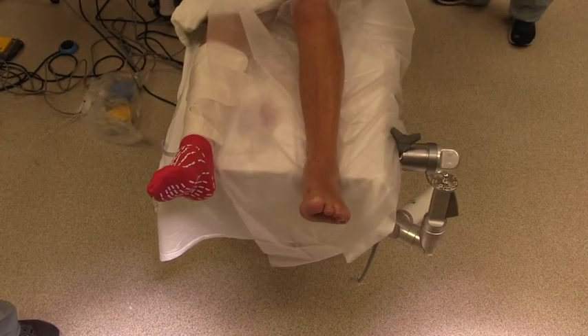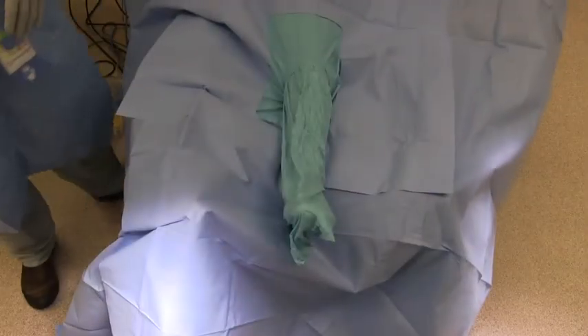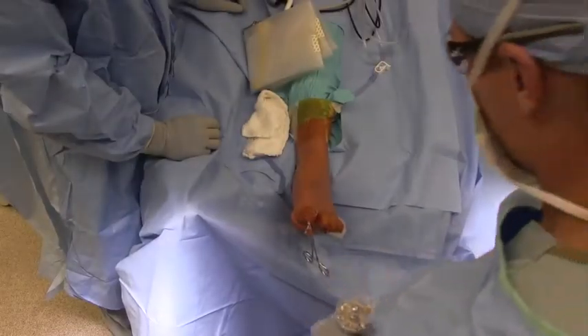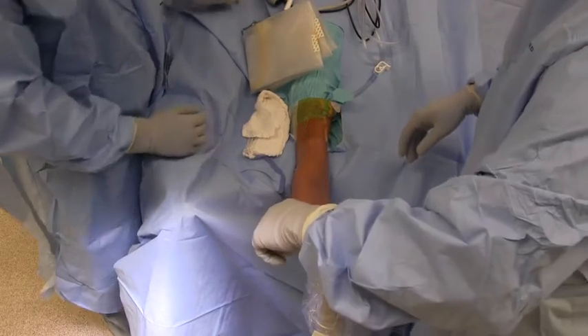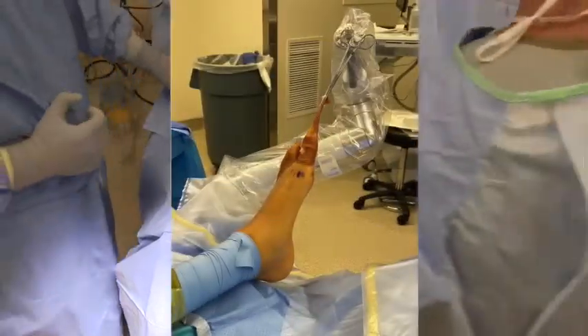Patient is placed supine on an operative table with the ipsilateral hip bump. Patient is then prepped and draped in typical sterile fashion. An external positioning arm is placed on the distal aspect of the bed to allow for joint distraction, thus allowing for increased workspace and visualization.